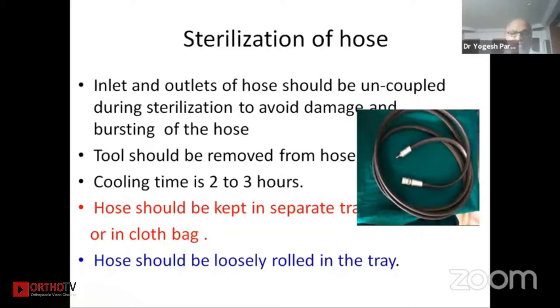The cooling time of the hose is two to three hours, so we have to wait until the hose has cooled down before use. The hose should be kept in a separate tray or in a cloth bag so it will not come in contact with other stainless steel instruments. The hose should be loosely rolled in the tray — if coiled too tightly it will get damaged by the temperature.